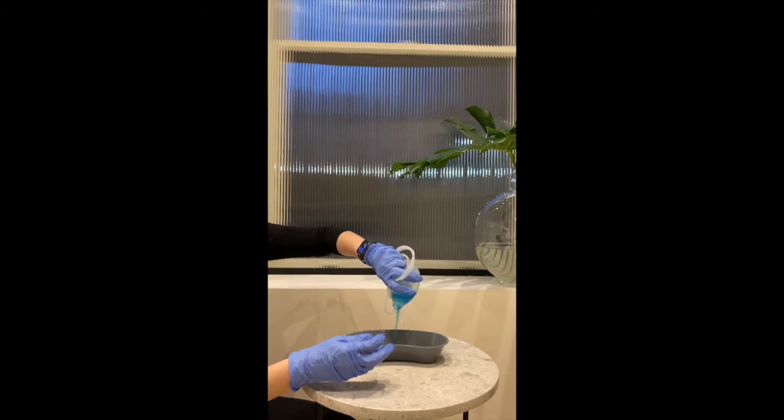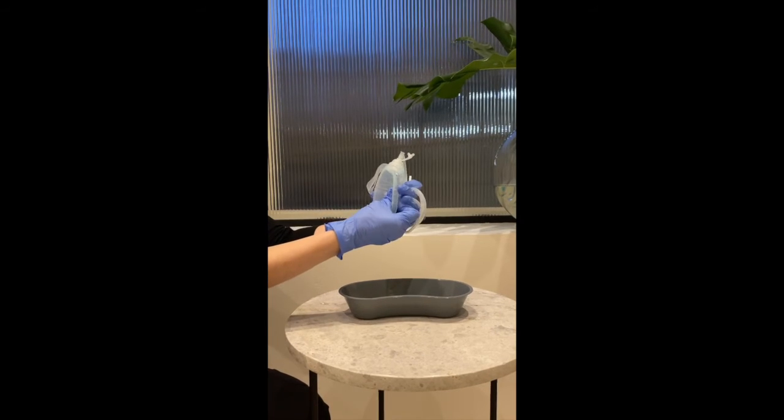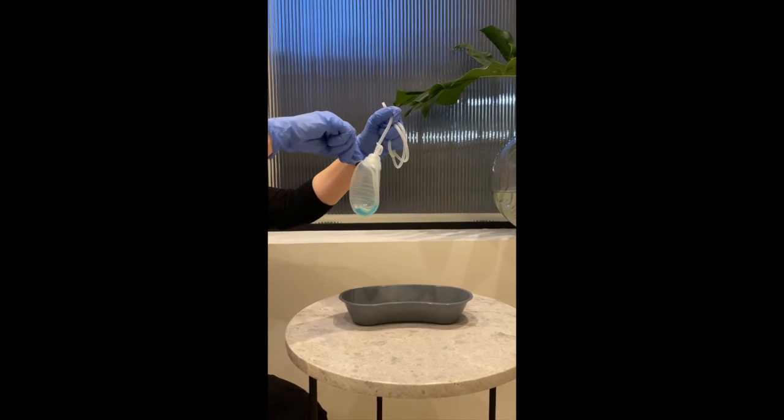Dispose the excess fluid from your drain. If there is a little bit of fluid remaining, it's okay. Once the drain is empty, make sure to squeeze the drain, releasing the air before closing. This helps the drain continue to work properly.